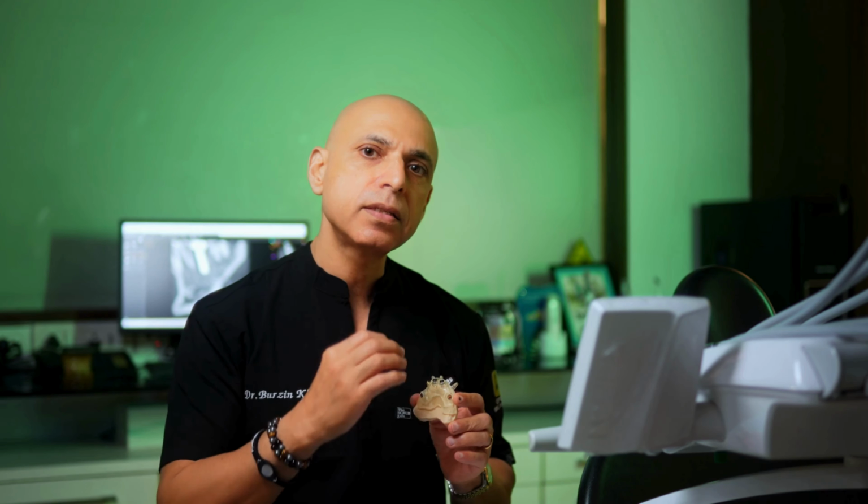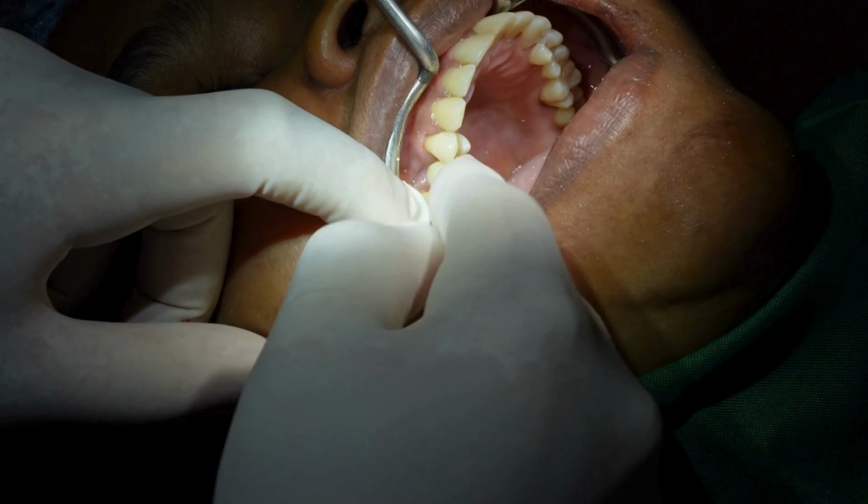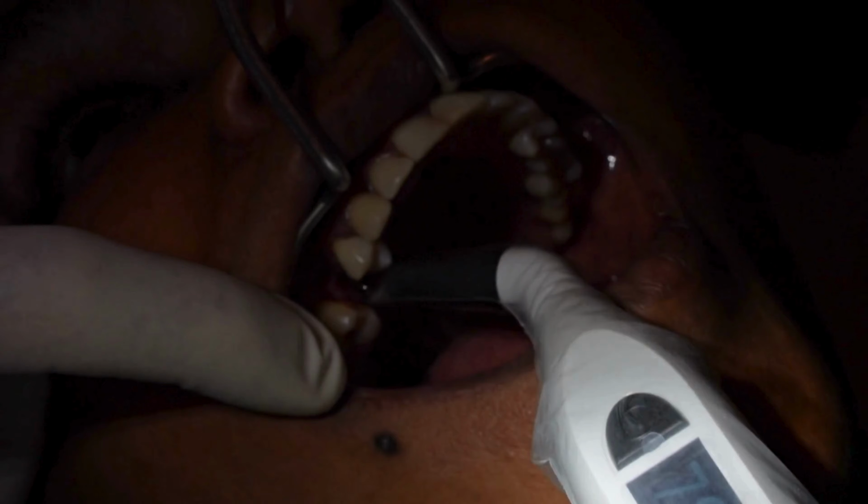This minimizes the risk of any problems in the restorative stage where we can have the tooth exactly as we have planned it. Using digital technology, what we also do is prefabricate the teeth according to the pre-planned implant position and keep it ready before the entire process. Therefore, on the same day, the tooth, if required, is extracted, an implant placed, and a tooth restored immediately for that particular patient. Of course, there are protocols to be followed in terms of achieving good implant stability before we do that.